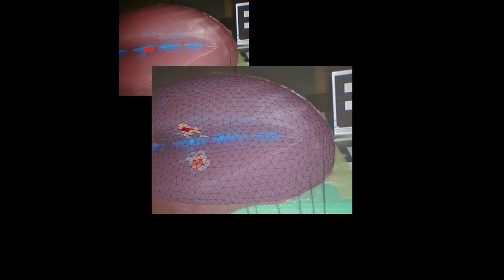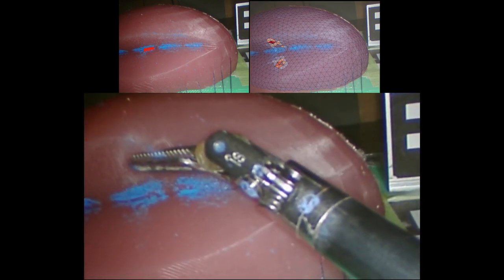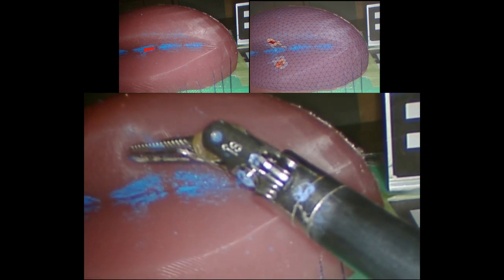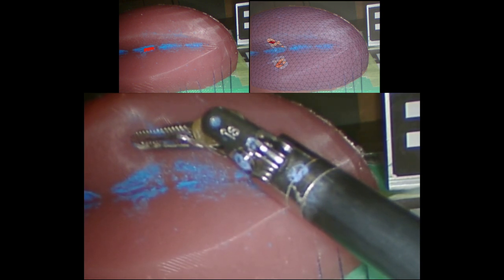The proposed method's performance is tested extensively on real-world pork tissue and silicone phantom with the da Vinci research kit. With a human-defined dissection goal, it automatically decides the optimal assistant position and exposes the dissection site efficiently to aid the dissection process.